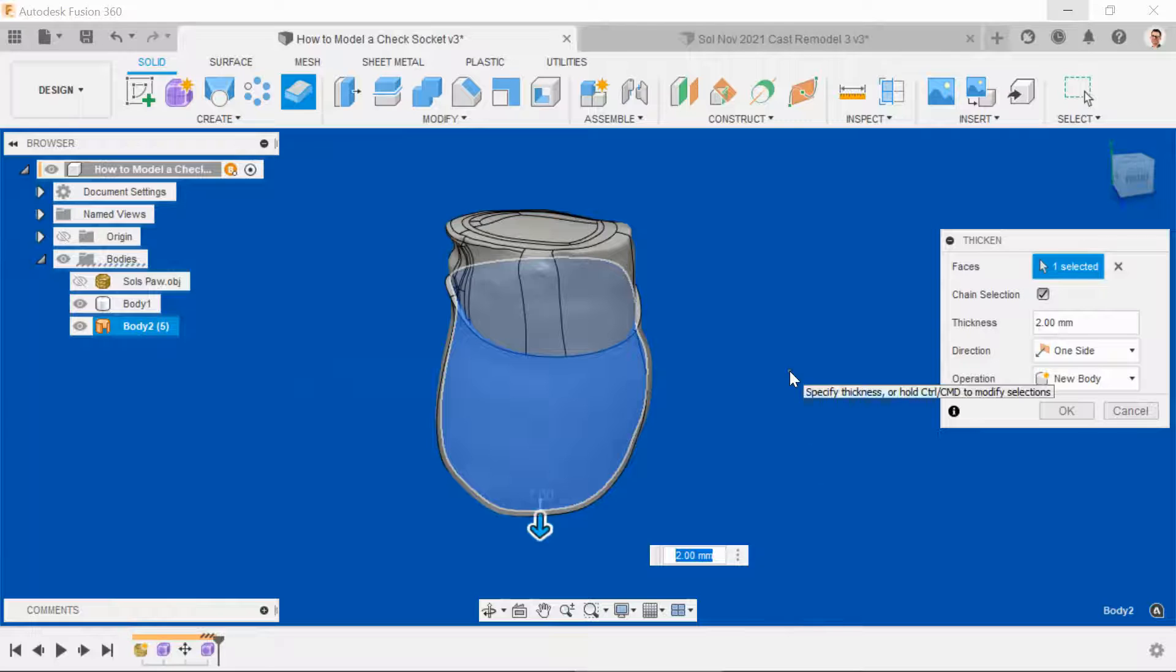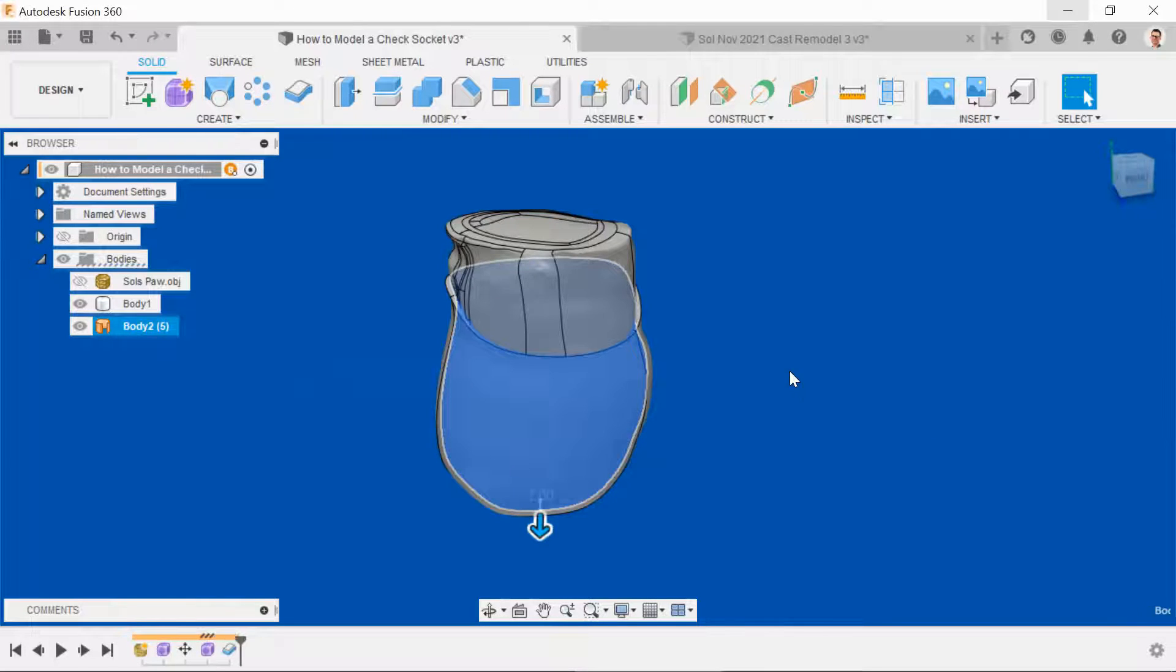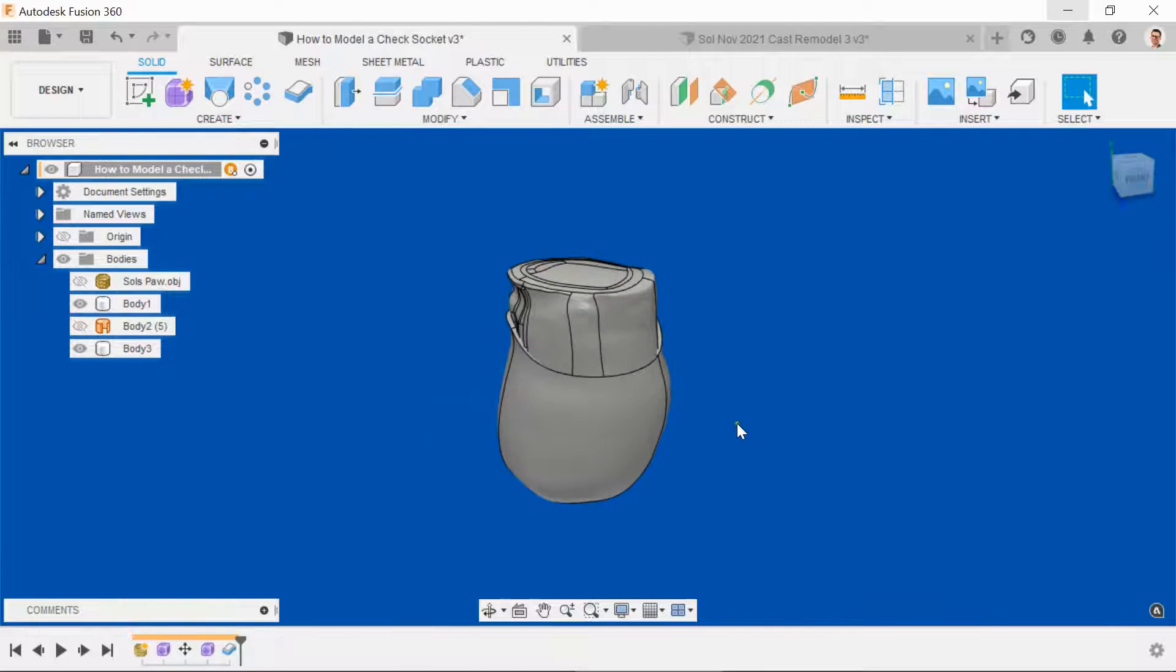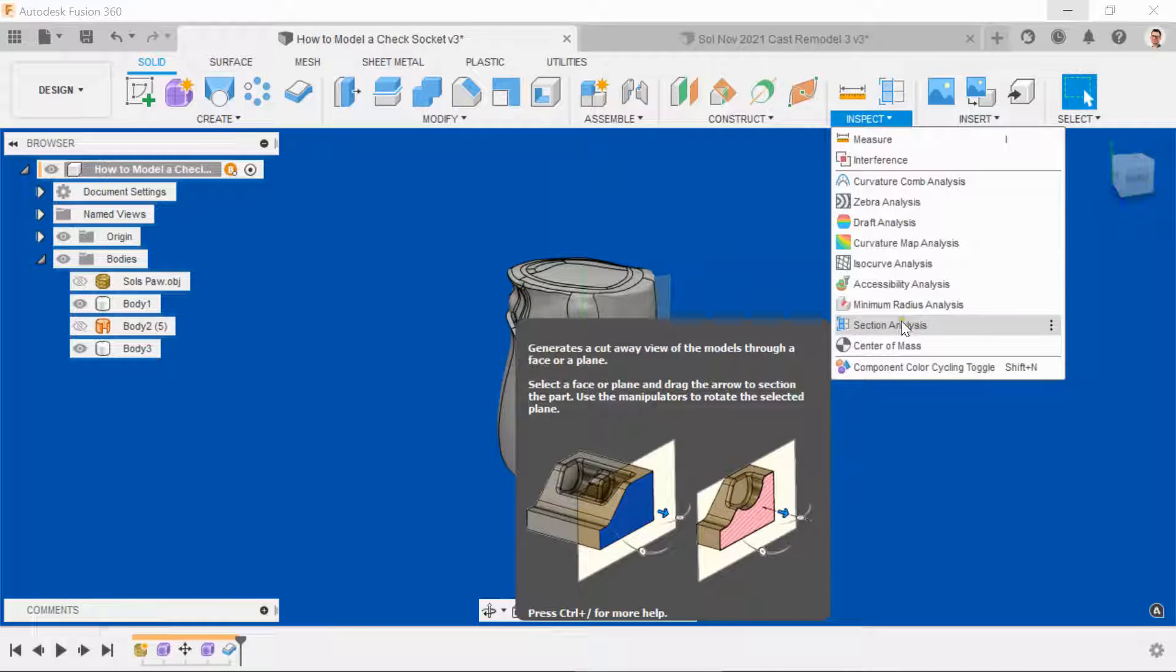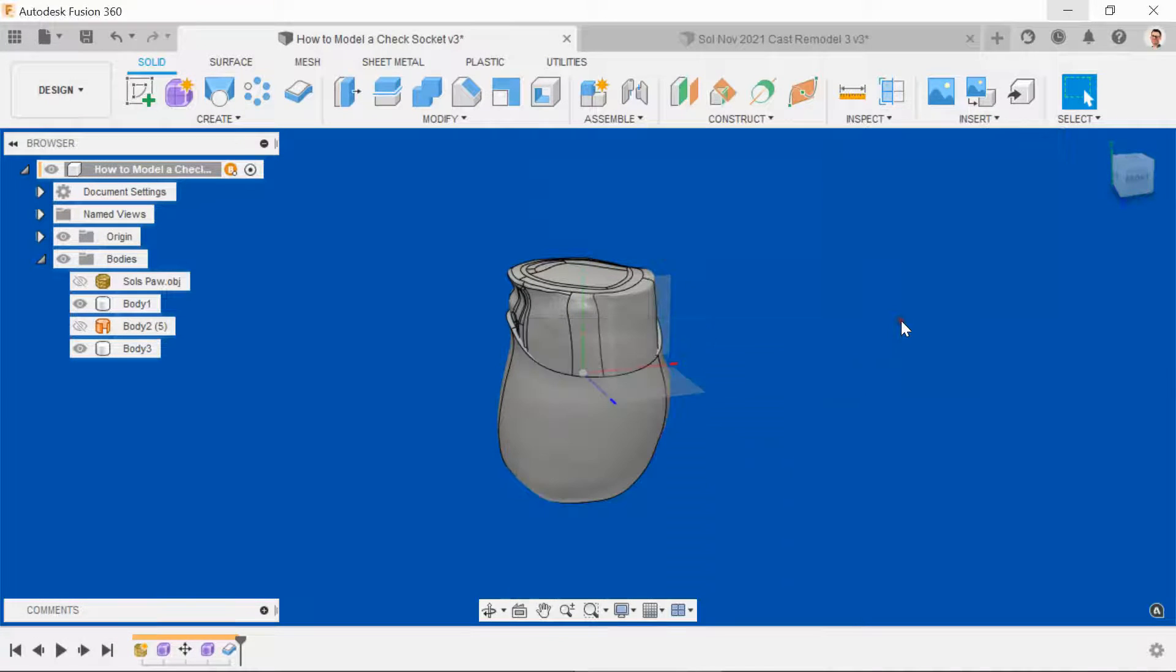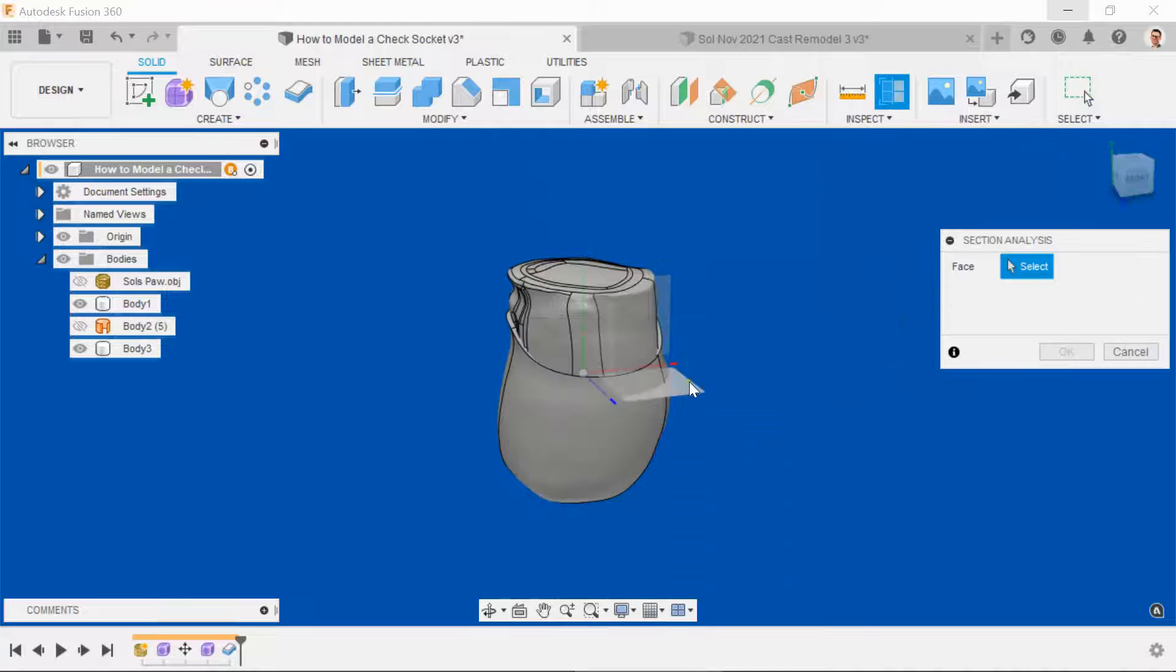For analysis purposes, 2mm is fine. What we now want to do, turn on the origin, go to the Inspect menu and click section analysis.